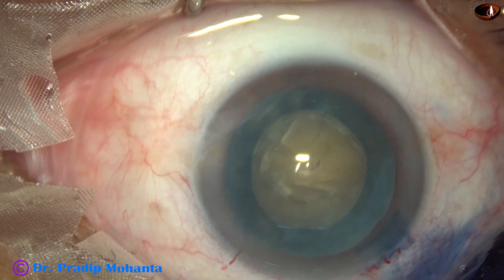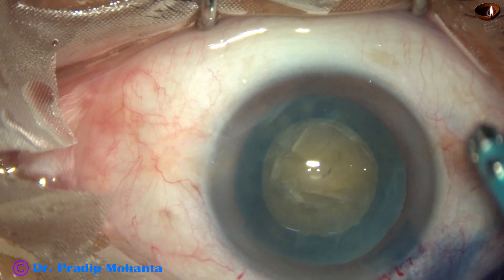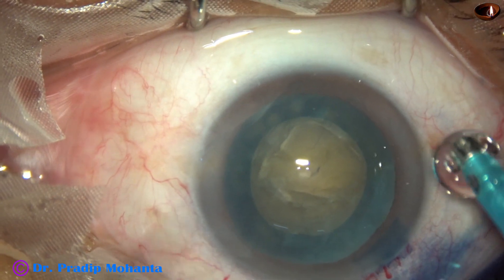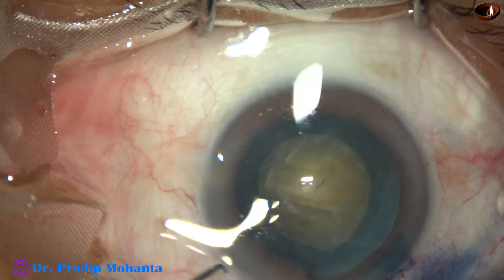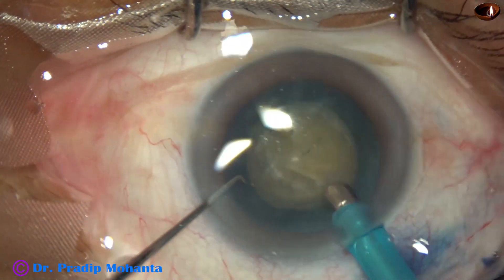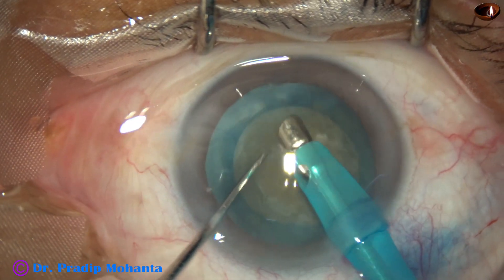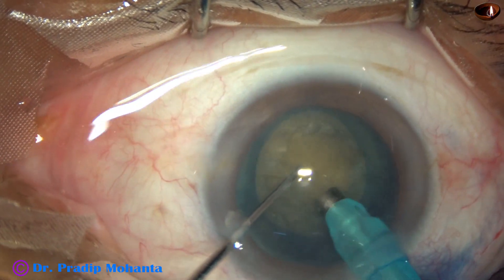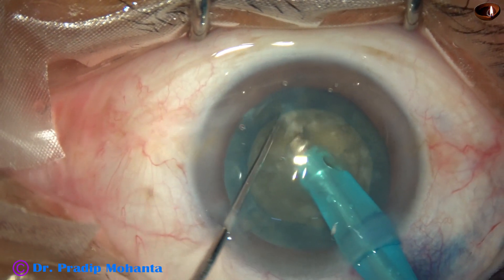The zonule will be weak if I tear off many zonular fibers. Hydro-dissection has been done with BSS, viscoelastic has been injected into the anterior chamber, and now here goes the phaco needle with its bevel down. Some superficial cortical lens matter is aspirated, and now the handpiece is turned to make the bevel up. This is my technique — submarine jaw.